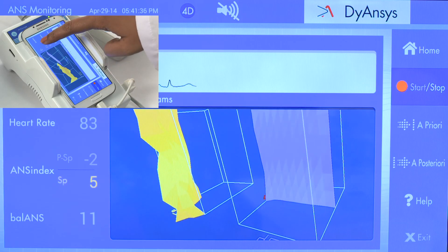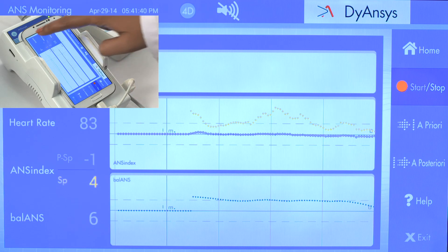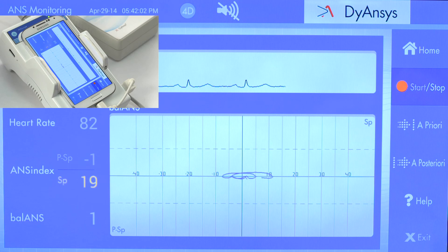Press ANS index. In about 30 seconds, you can view the sympathetic, parasympathetic, and balance indices. Select the Balance to view the balance trajectory. Choose A priori to save the balance trajectory before ANSYSTEM treatment.